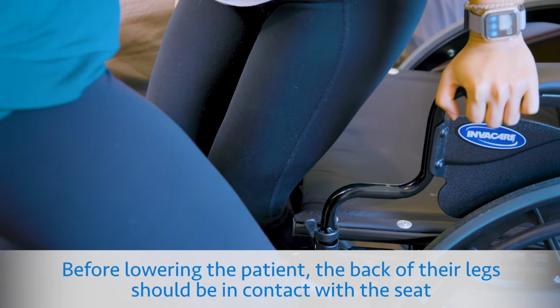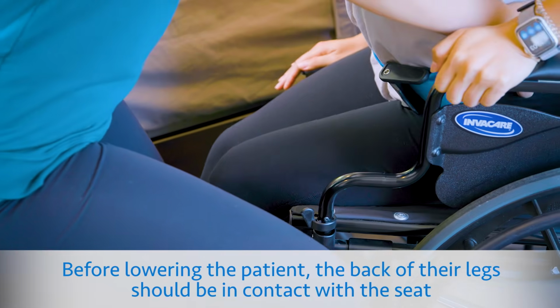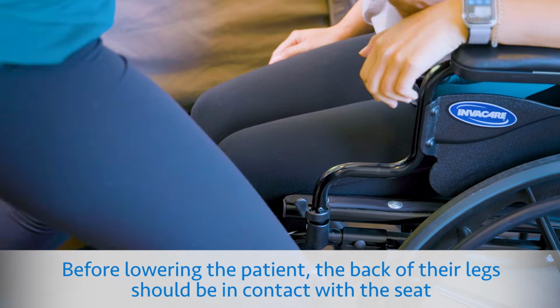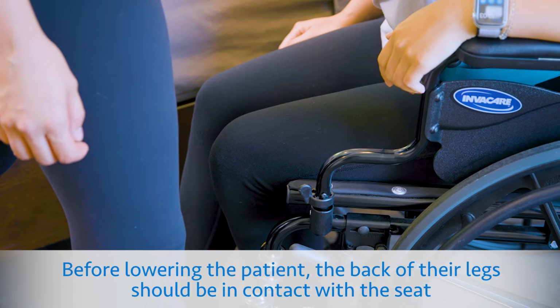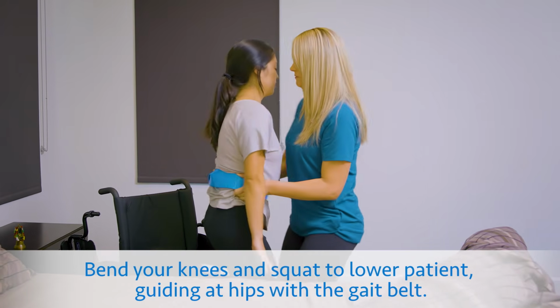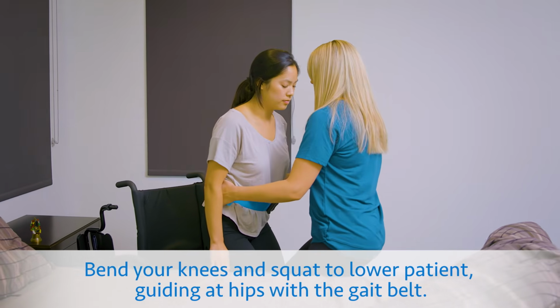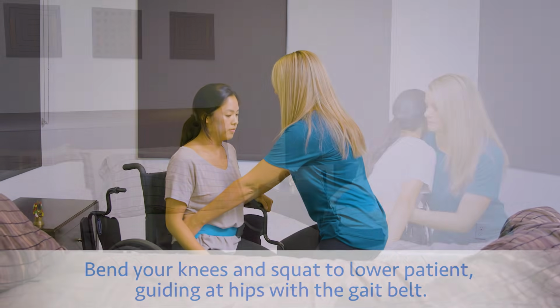Before lowering the patient into the wheelchair, the back of their legs should be in contact with the seat. This will ensure the patient is lowered adequately into the seat and not too close to the edge where they may be at risk for falling off. Once the patient is in line with the seat of the wheelchair, bend your knees and squat to lower the patient into the seat, guiding at the hips with the gait belt.